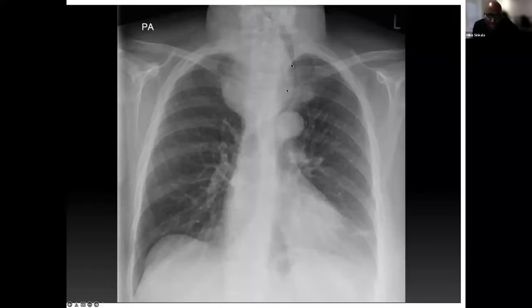I am not too sure on this plain X-ray whether we can rule out what we call tracheomalacia, so a patient would possibly need a CT scan if you are worried about tracheomalacia, but there is good aeration or ventilation of both lungs in this case. So I think this could just be a retrosternal goiter, which is causing this appearance with the tracheal deviation to the left side.